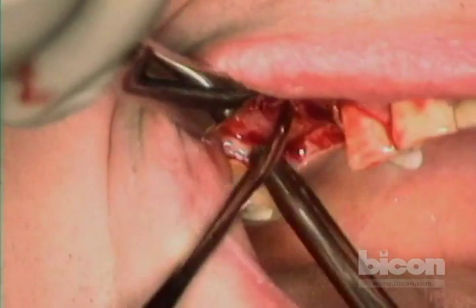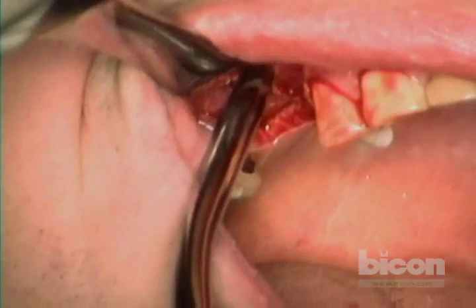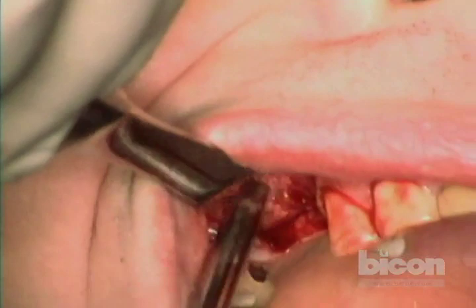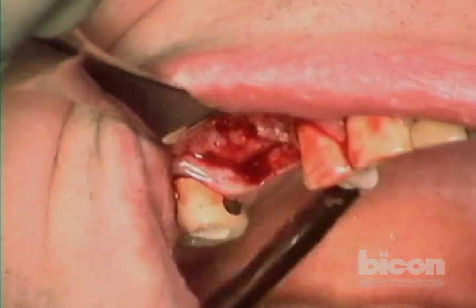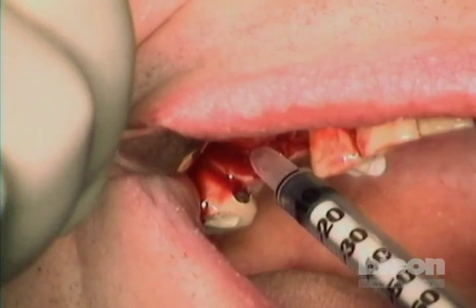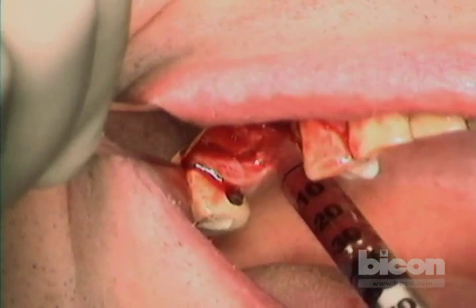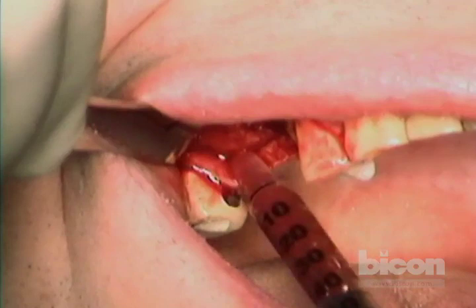I'll take a retraction suture for convenience and visibility. This graft is definitely not bank bone — it could be Neo-Oss or something similar. Some of it is incorporated, some is sloughing off, but either way we should have enough to place our implant. I'm going to first collect a little bit of blood from the surgical site, which we will use in the graft, thereby avoiding a venipuncture.